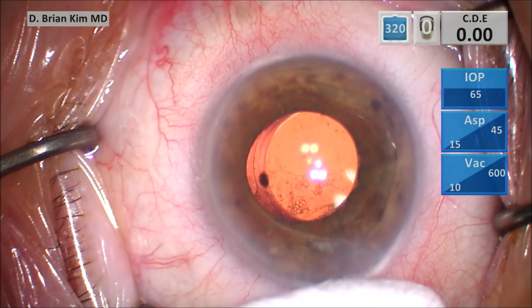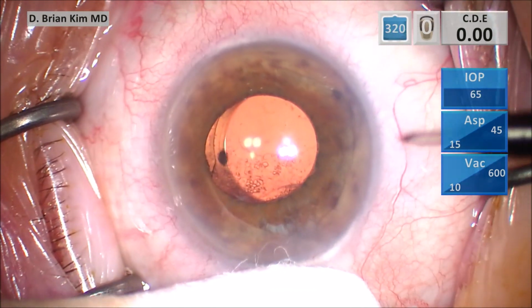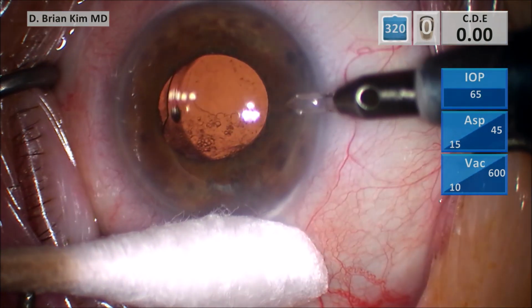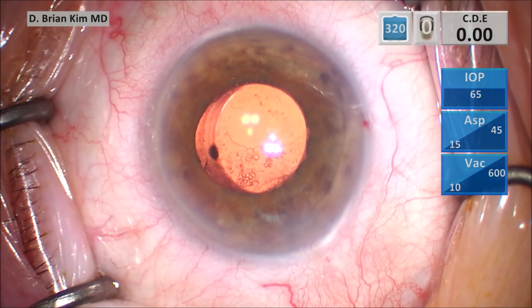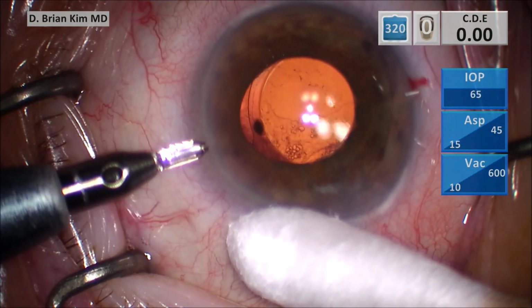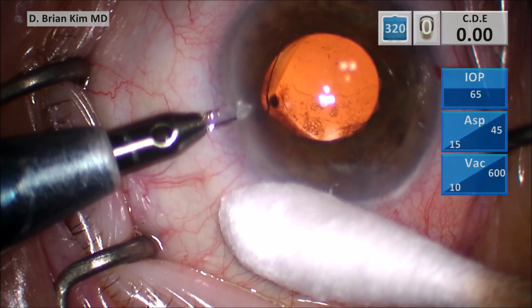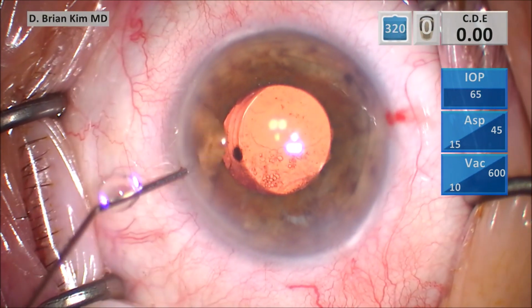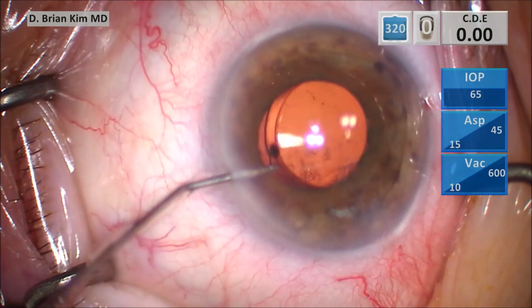So I go ahead and make my incision first on the right side and then the left side. This is some intracameral epinephrine.